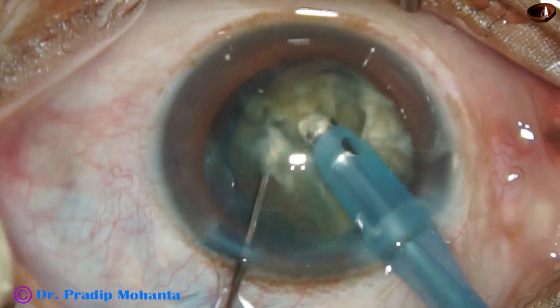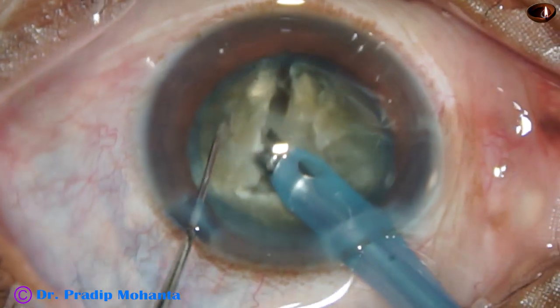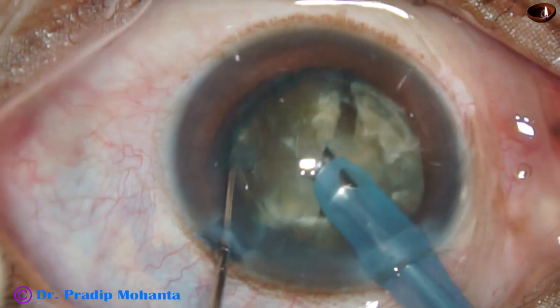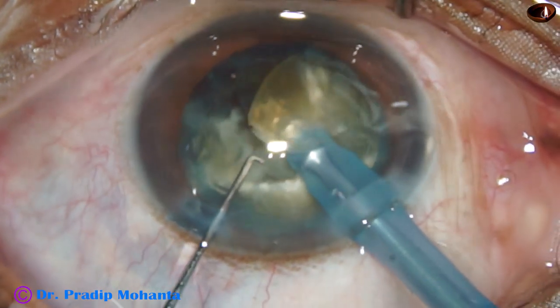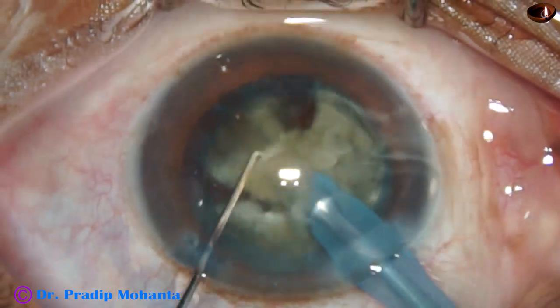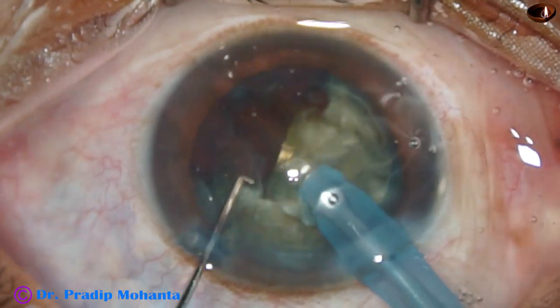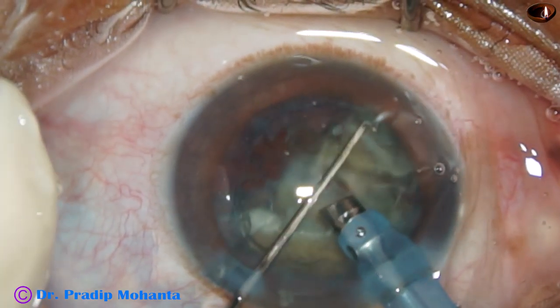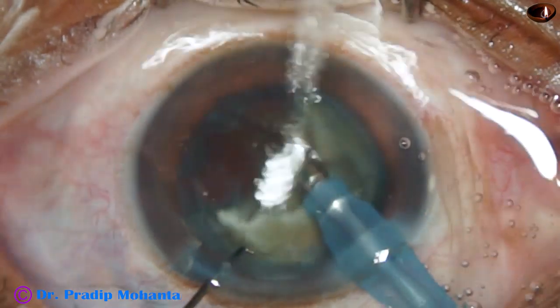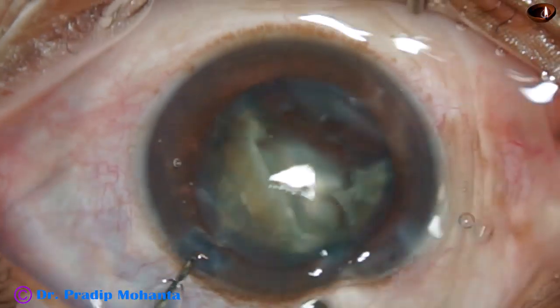Now each hemi-nucleus is being divided into three fragments in this case. One fragment has been done and these are the other two fragments. Now the three nuclear fragments are being emulsified using ultrasonic energy, which is 70% in this case, with a flow rate of 45 ml per minute and vacuum of 450 mmHg.